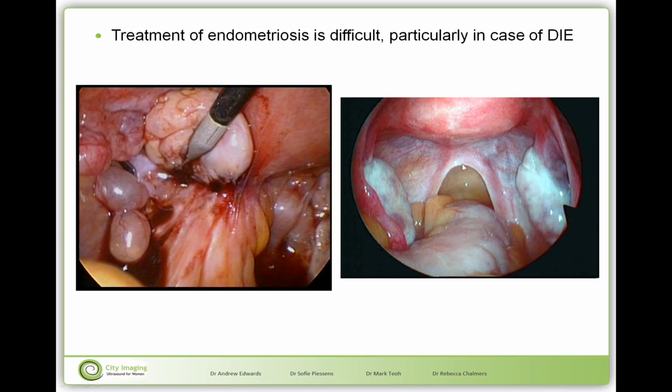Often endometriosis will first occur on the sacrouterine ligaments, and a nodule will form on these ligaments. From there, endometriosis can then infiltrate into the vaginal wall, causing a vaginal nodule, of which we will see an example later on. The endometriosis can also cause adhesions with the bowel and even infiltrate the bowel wall, causing a bowel nodule. Pouch of Douglas obliteration is defined as adhesions that make it impossible to visualize the pouch of Douglas.